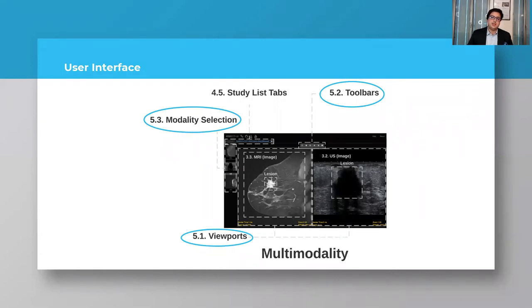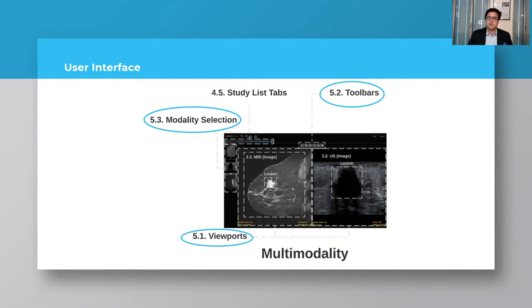The second component is the medical imaging diagnosis view. Here we have the viewports where clinicians can interact with mammography, ultrasound, and MRI using a set of features according to the toolbars. Finally, clinicians can change the respective modality using the modality selection freely.